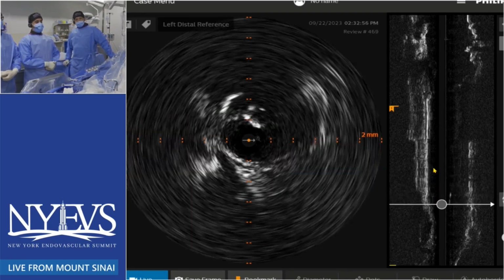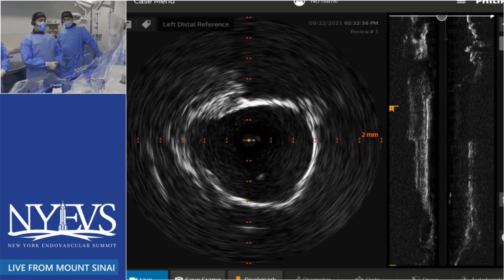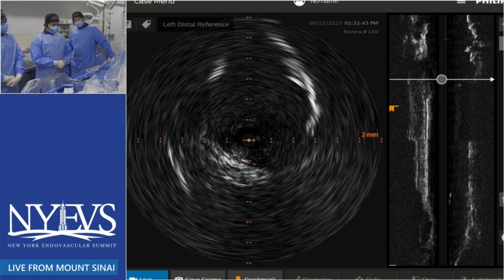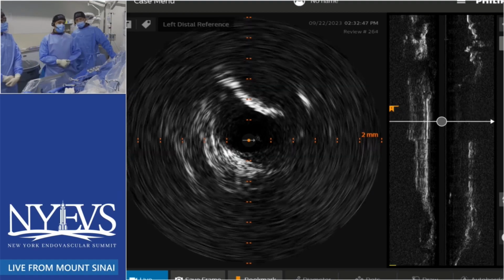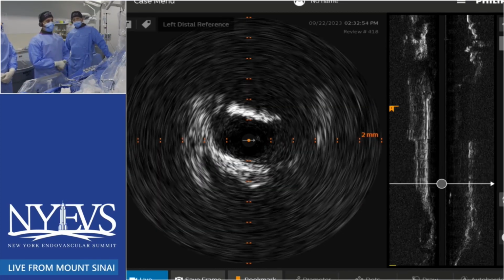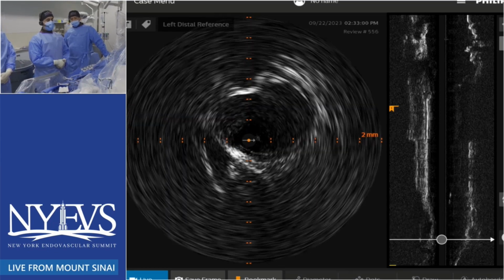Right, so you can see that luminal compromise again. The right actually doesn't look that bad on the angiography, but it has a very eccentric calcified lesion. So how many are now in favor of shockwave, how many not? No, I think it's reasonable now, seeing the morphology. Yeah. So I think our plan initially was to shockwave it, see how you do, and get away with bare metal self-expanding stents. To do a bifurcation with self-expanding stents, not use a covered stent, with the focal morphology we have after the shockwave.